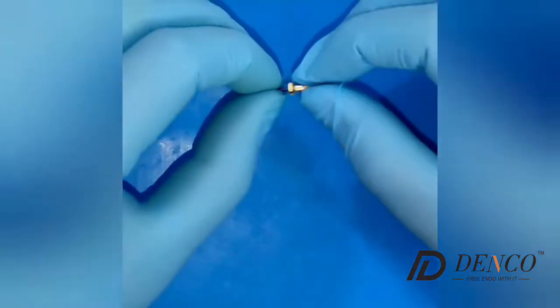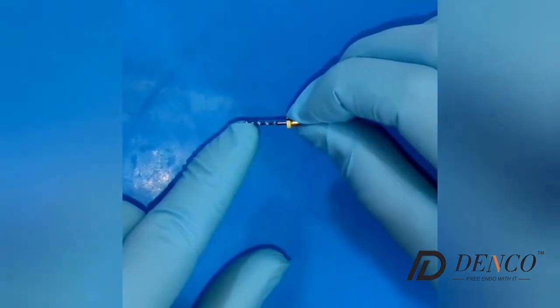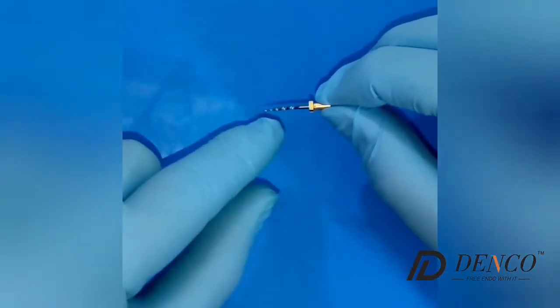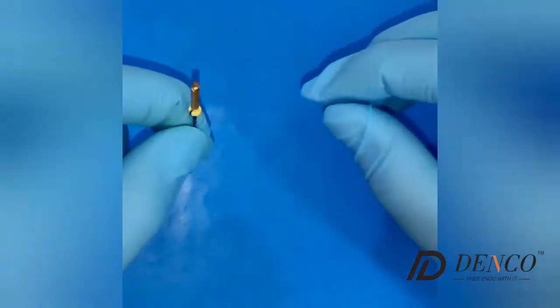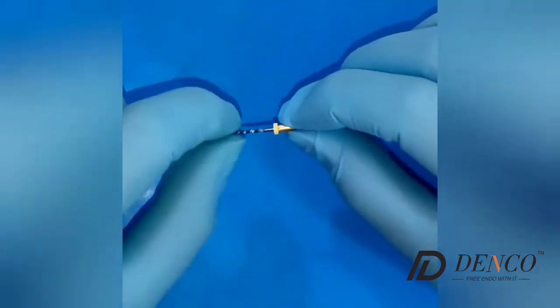We have here the Denko Superfiles 3. As you can see, they are heat treated and have a blue color. This is the SX file with high flexibility. The SX file is meant to treat only the coronal part of the canal — the coronal third of the canal.